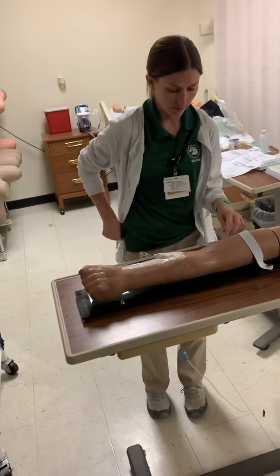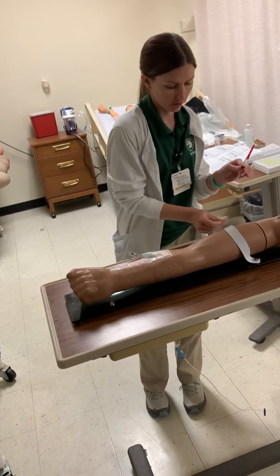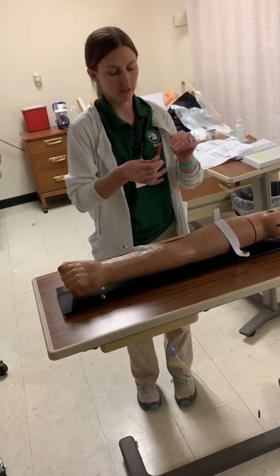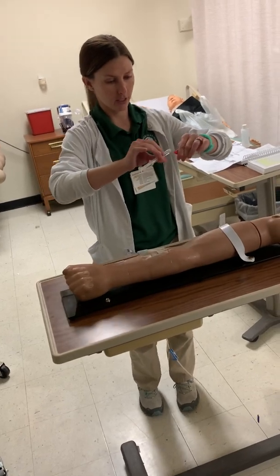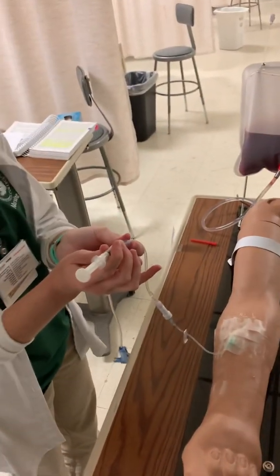All right, I'm going to take my label off so I can see exactly how much I'm pushing. And I'm going to take my needle off since this is a needleless push. All right. Now I'm going to attach my medication.